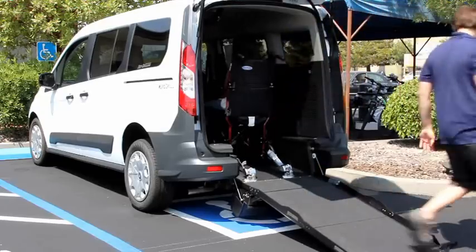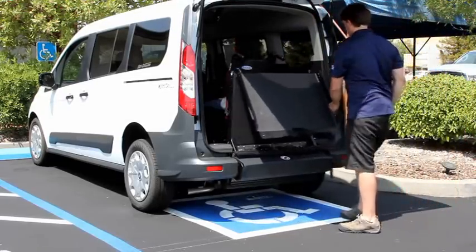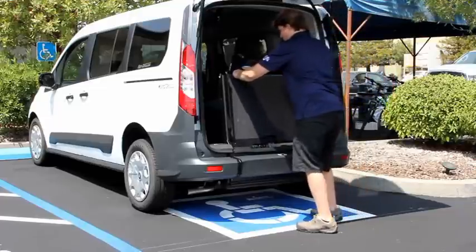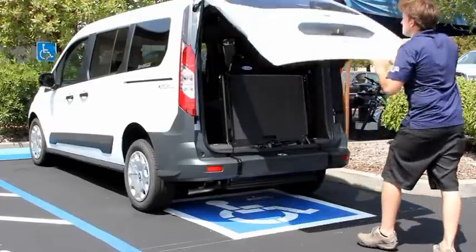To store the ramp in the vertical position, grab the upper and lower handles. Lift up the ramp and walk toward the van carefully. To lock in the vertical position, push on top of the ramp until it clicks. And now you're ready to go.